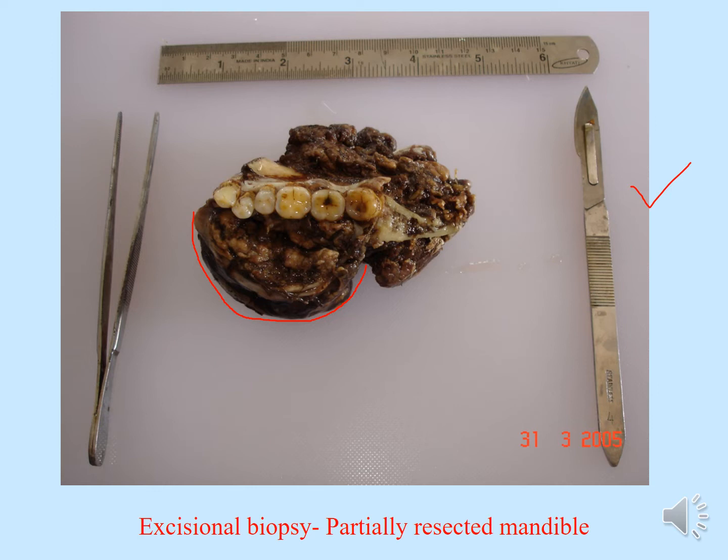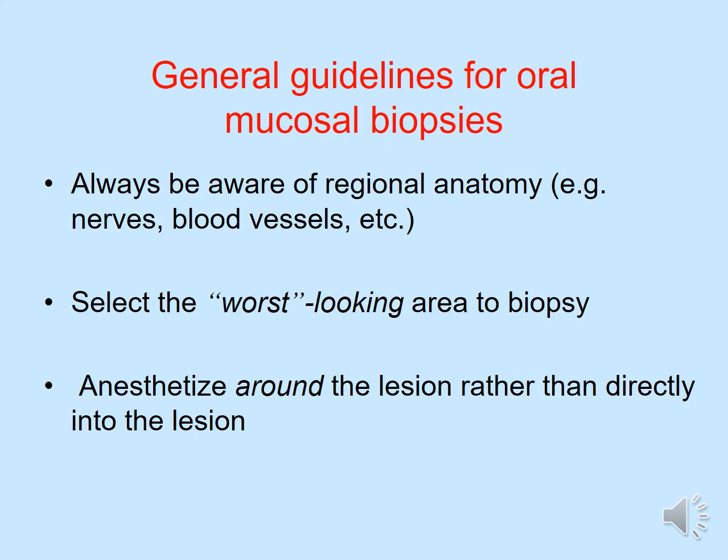This is the mandible here, these are the teeth over here, this is the tumor, and these are surrounding muscles and other structures. This is an example of excisional biopsy, and this is a table where these biopsies are studied. We do something called grossing to section them and further study them and come up with our final diagnosis.